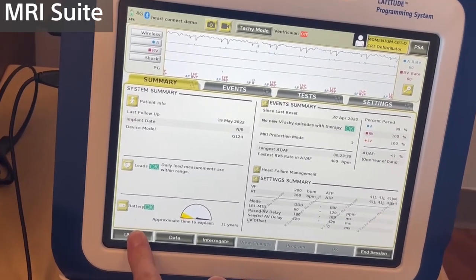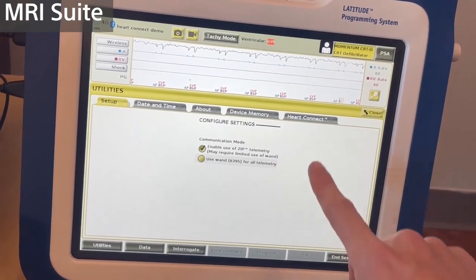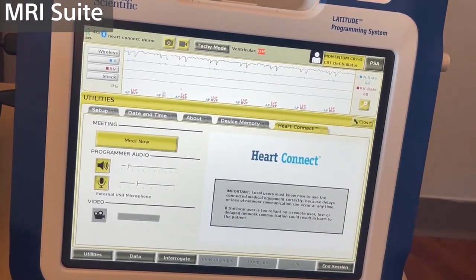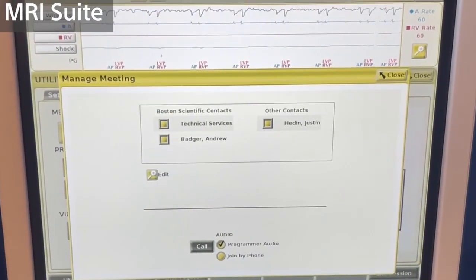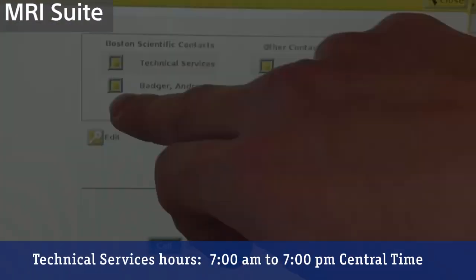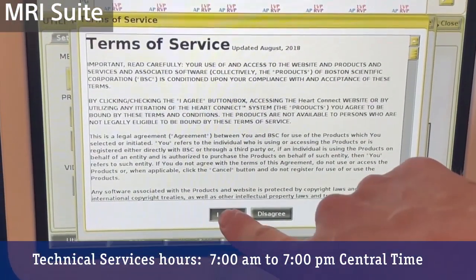From here, we go down to the bottom left-hand corner where it says Utilities, and then we can access our HeartConnect tab, which is in the top right. From here, we select Meet Now, and a list of contacts will become available that have been preloaded in the programmer. For this demonstration, I'm going to select Andrew Badger, but you can see Technical Services is always available as well.